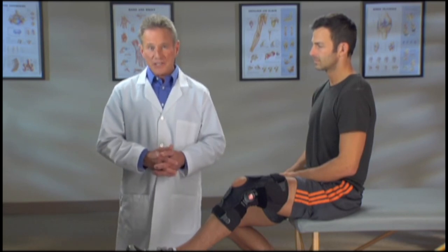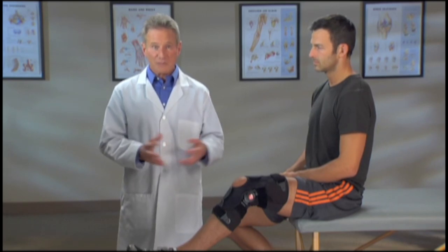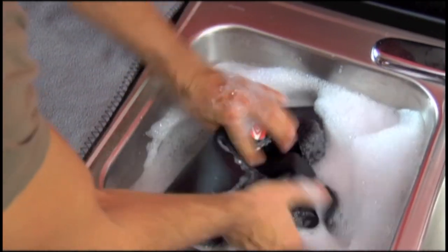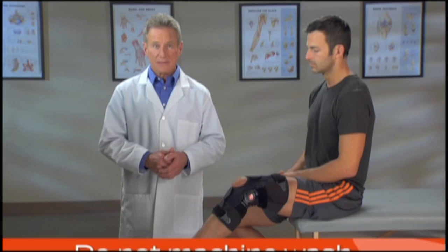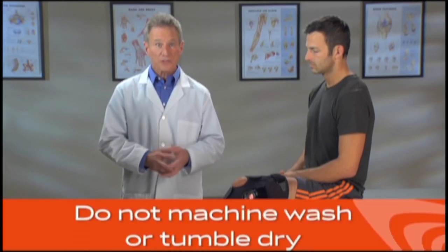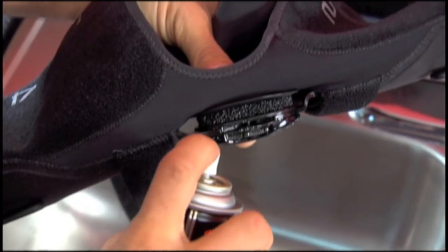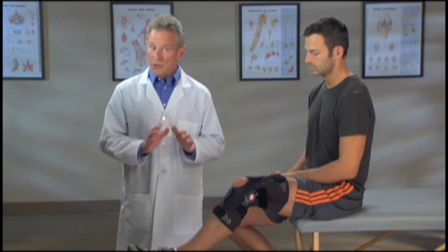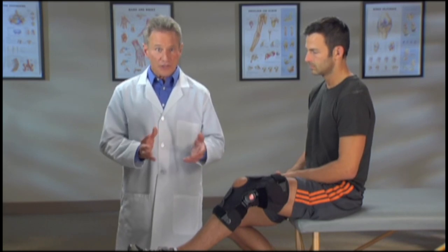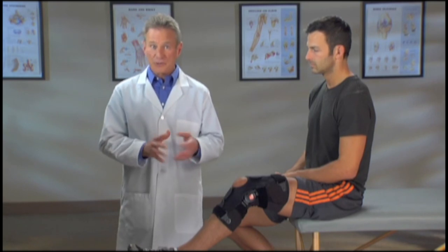You'll need to clean your Freestyle OA brace periodically, depending on your activity level and how much you perspire. Hand wash your brace in cold water with a mild detergent. Rinse, lay flat, and air dry. Do not machine wash or tumble dry. Occasionally, you may want to apply a dry lubricant like Teflon spray to the hinge after washing. Don't use WD-40 or other solvent-based products, oil, or grease, since they can attract dirt to the hinge.